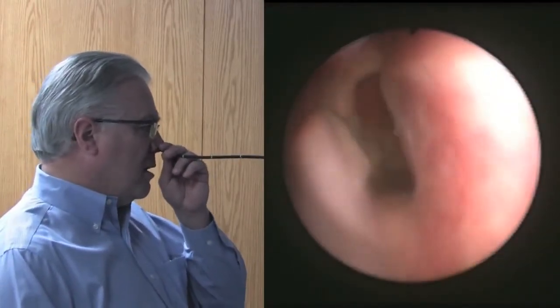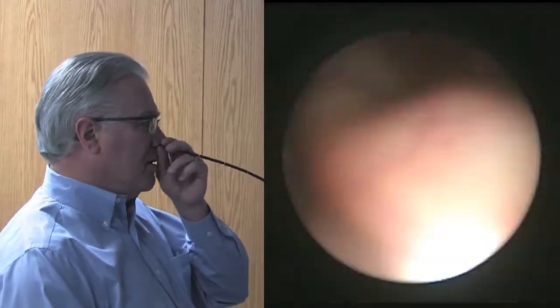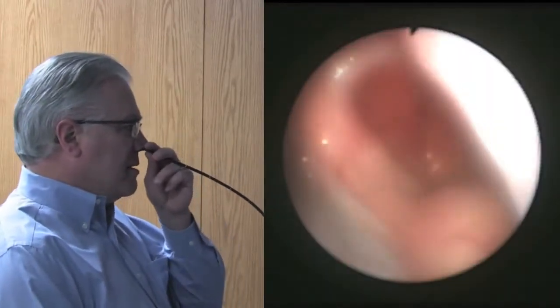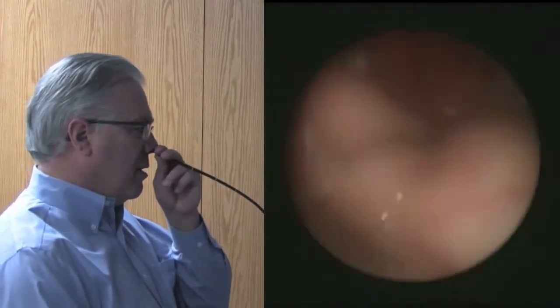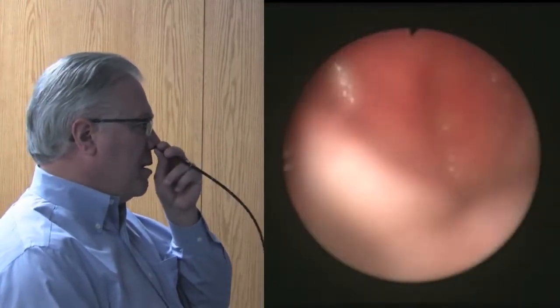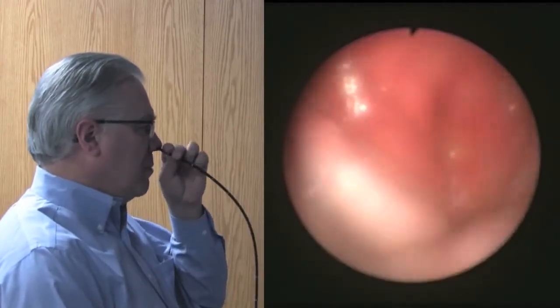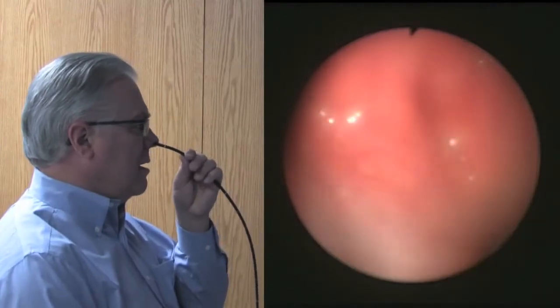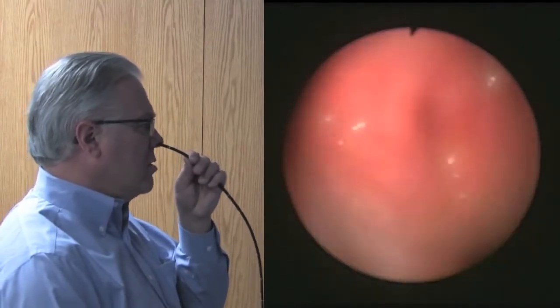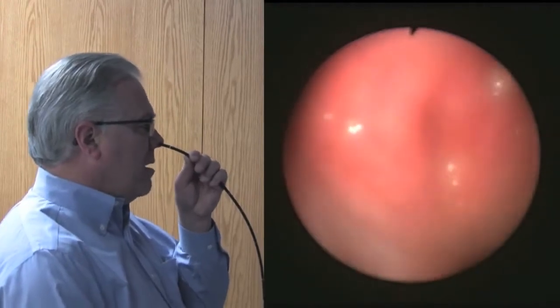I've been holding onto the scope for a little while in order to warm it up, because by warming it up, I'm able to minimize the amount of fogging. As I come through the back of my nose, you can see my soft palate rise and fall. And then you can see a pit. And that pit, which is cherry red, to the right of the screen in the center, is the area where the eustachian tube comes down from my right ear into the back of my nostril.